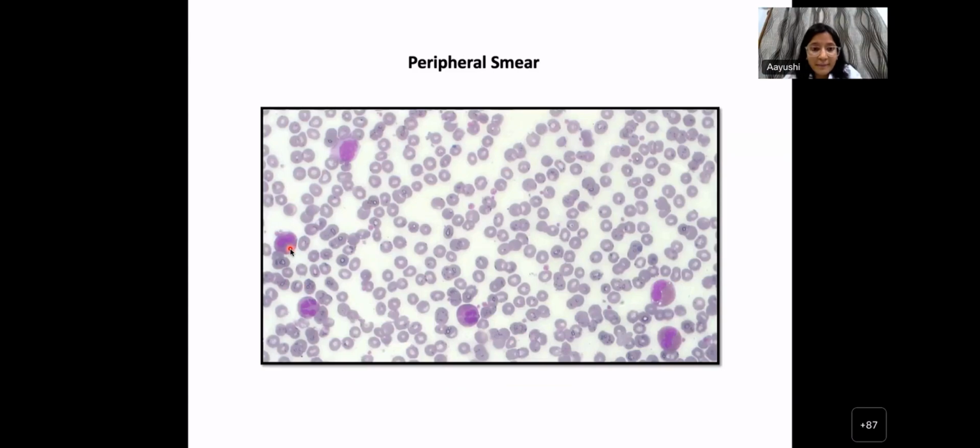Can you describe them? Yes, sir. The cells are showing a binucleate, bilobed nucleus, with a spectacle shape, and the granules are orangish red colored granules. Yes, so they are eosinophilic granules, right? Classically, we use the term acidophilic for them. So these are eosinophilic brick red granules. The difference in color is not very evident here, as the slide is very old actually.